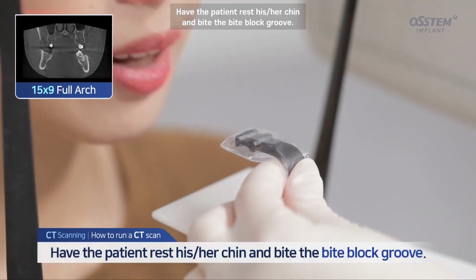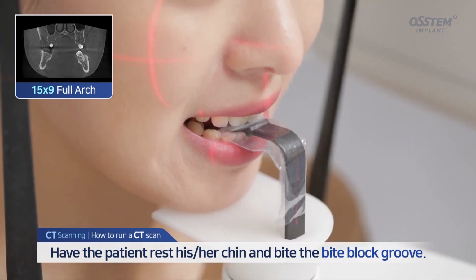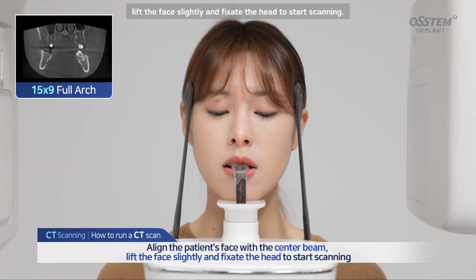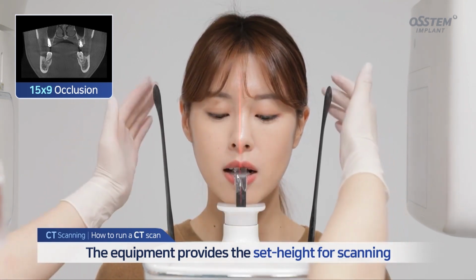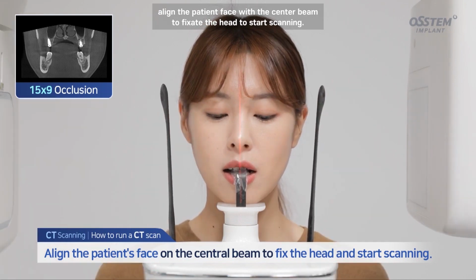Have the patient rest his/her chin and bite the bite block groove. Align the patient's face with the center beam, lift the face slightly and fixate the head to start scanning. An occlusion scan is able to cover a greater area of the maxillary sinus than a full arch scan, since the equipment provides the height set for scan. Align the patient face with the center beam to fixate the head to start scanning.